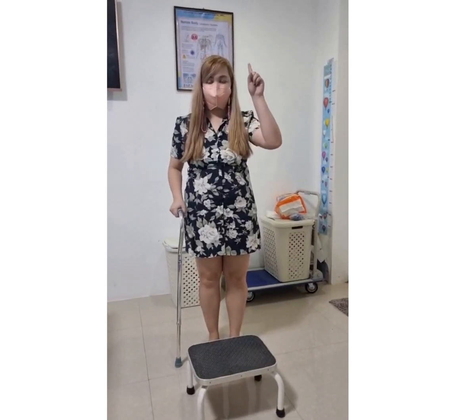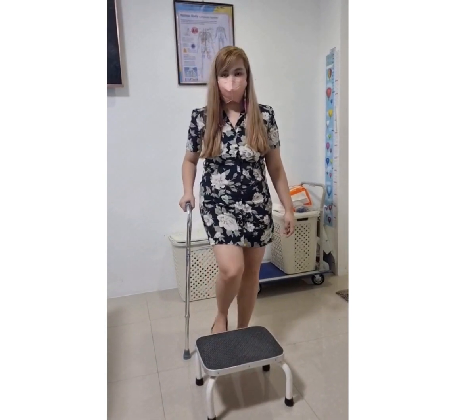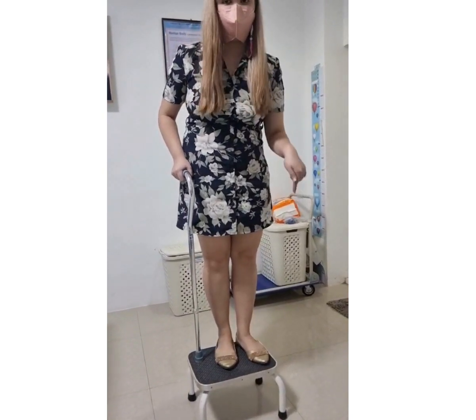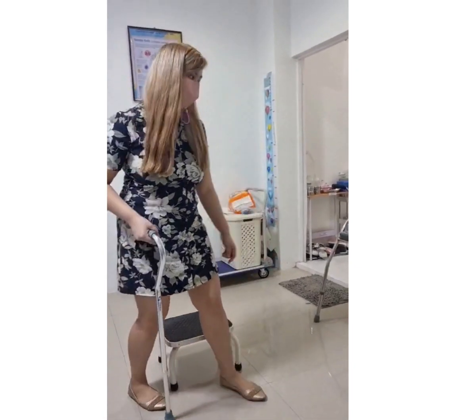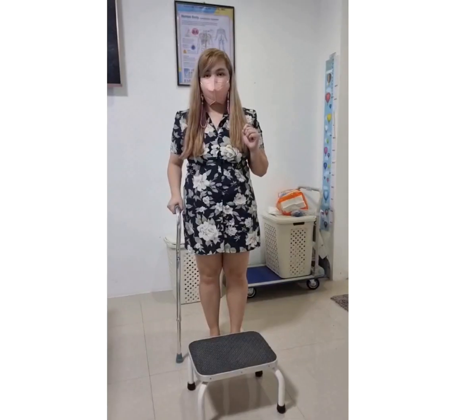Ulitin po natin. Pataas, at saka pababa, ganito po. Good leg, followed by cane with bad leg. Pababa, cane with bad leg, and then good leg. Okay? Again, good leg goes to heaven, bad leg goes to hell. Don't forget this.